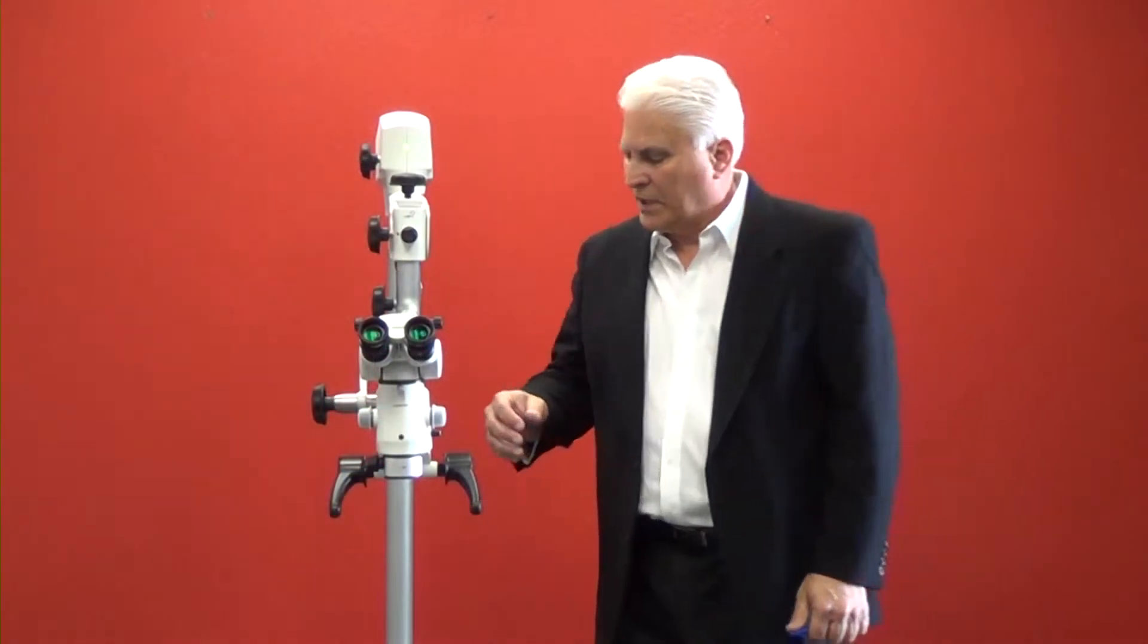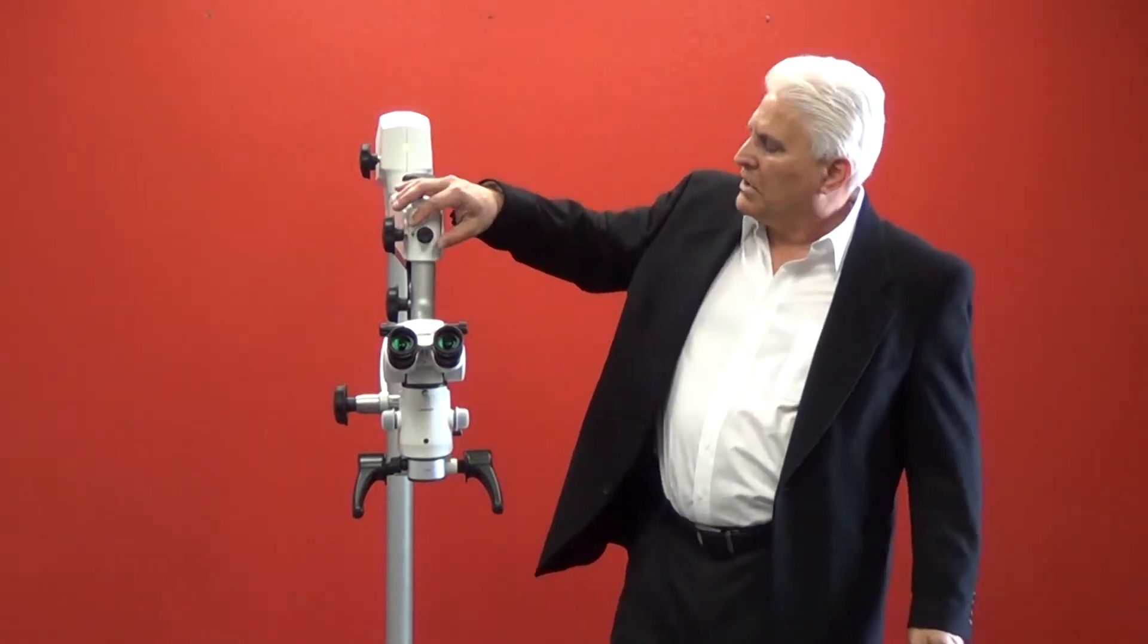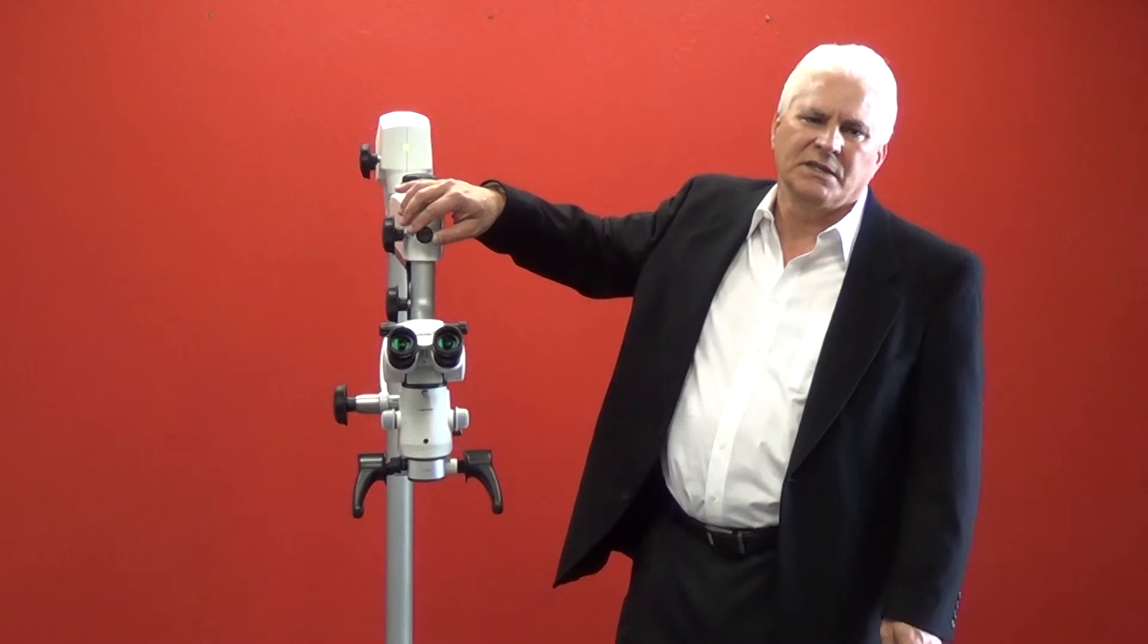Then you demonstrate the controls. First we have the rheostat for light intensity, conveniently placed directly over the doctor's head while he's seated.